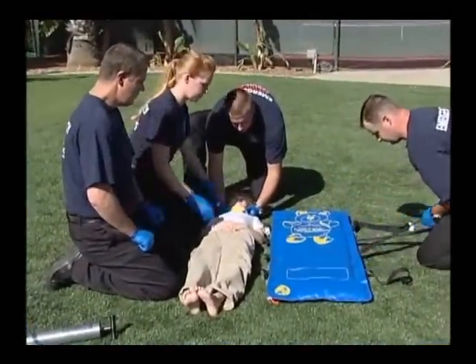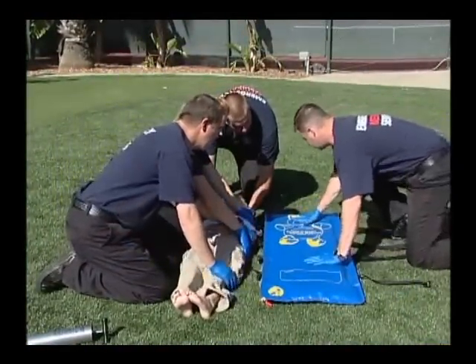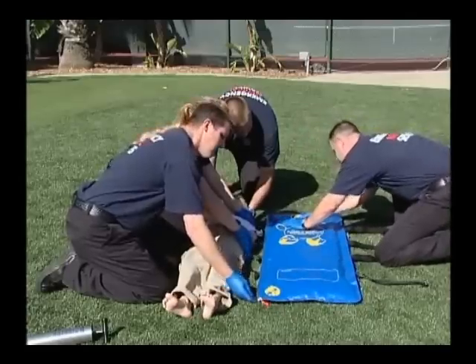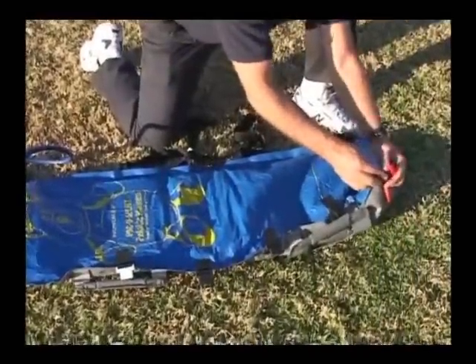Lay the evacu-splint pediatric mattress out on a flat surface near the patient. The teddy bear logo indicates the head end of the mattress. Remove the red vinyl leashed cap from the valve.